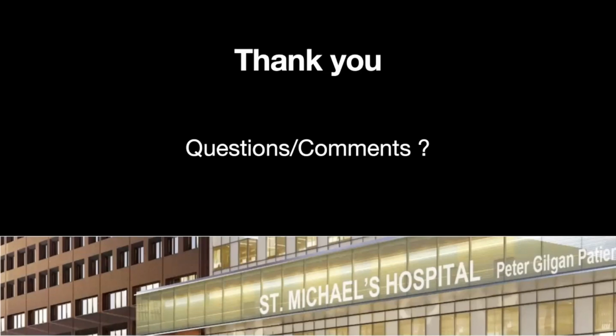So I think you've raised the issues with the follow-up, of course, that if you don't get the peak velocity, and the right peak velocity, that's a problem. Everybody knows that. And I think one of the things we don't do very well is document where we got the peak velocity, so that if you're comparing it, if in one case it was achieved at the right parasternal border, we don't necessarily always know that, and I'm not sure that we always work hard to get that same spot for the peak velocity in the follow-up studies. So that's one point.